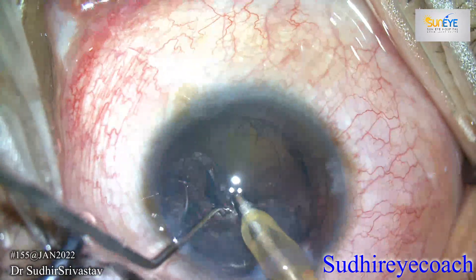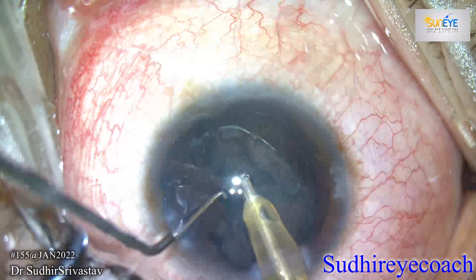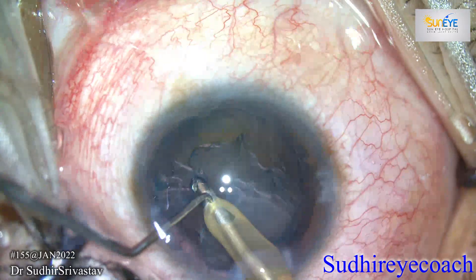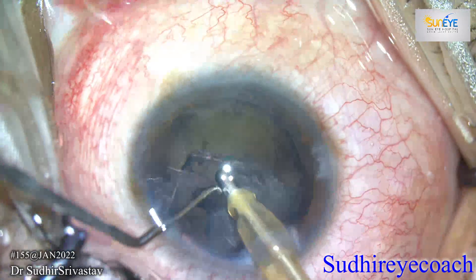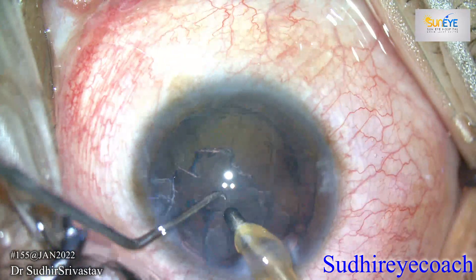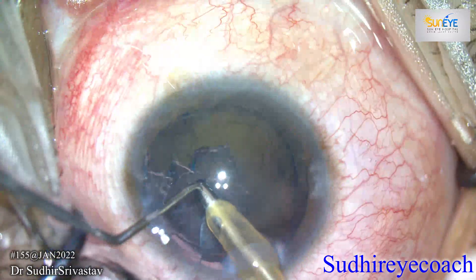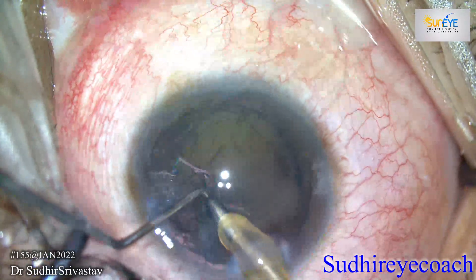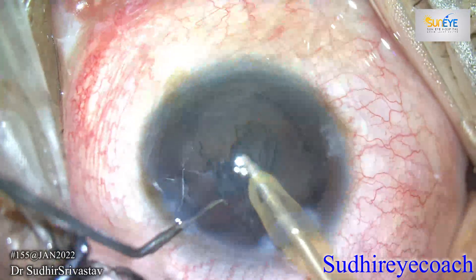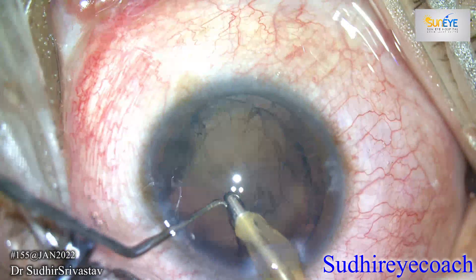During cortical cleanup, I was keenly observing any change in the shape of the capsulorrhexis and the equator of the lens bag. A sudden change in the shape of the capsulorrhexis is always indicative of capsular dehiscence. The posterior capsule was also loose and mobile, so I continued cortical removal very carefully. In younger patients, cortex fibers are strong and sticky, so cortical cleanup requires patience and must be done under proper visualization.